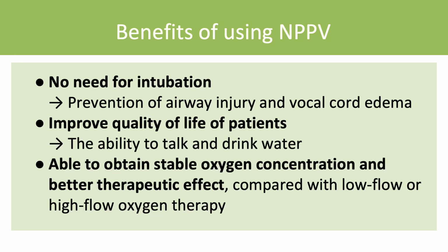Why is NPPV needed instead of intubation such as IPPV? NPPV prevents airway injury and vocal cord edema because it does not require intubation. Also, a non-invasive ventilation mask is easy to put on and off, so it can improve patients' quality of life as they have no problem communicating and drinking water. Compared to oxygen therapy and high-flow therapy, NPPV has advantages such as stable oxygen supply and therapeutic effect, which makes it the treatment of choice.